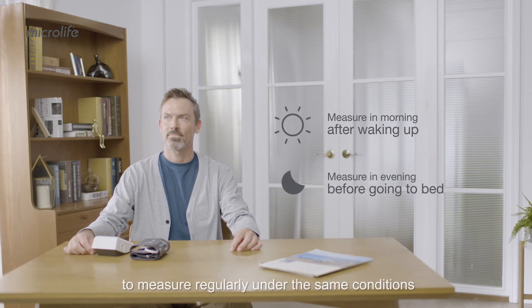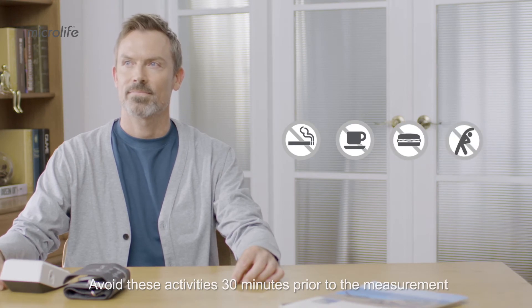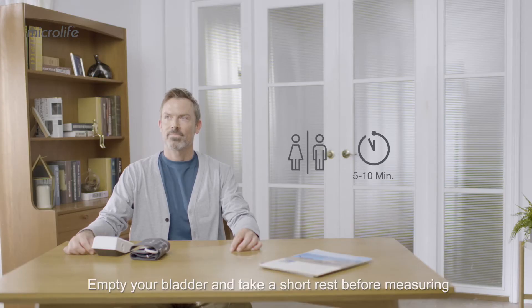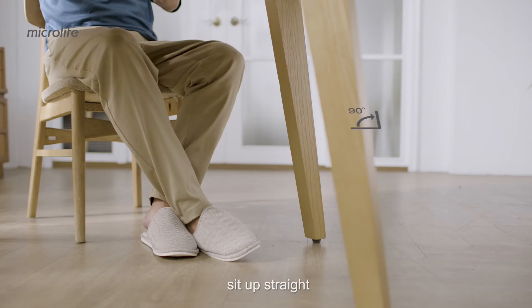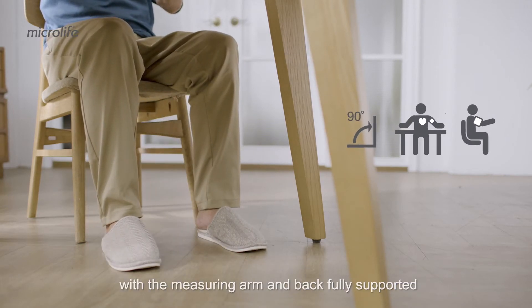To measure regularly under the same conditions, avoid activities 30 minutes prior to the measurement. Empty your bladder and take a short rest before measuring. Sit up straight, legs uncrossed, feet flat on the floor with the measuring arm and back fully supported.